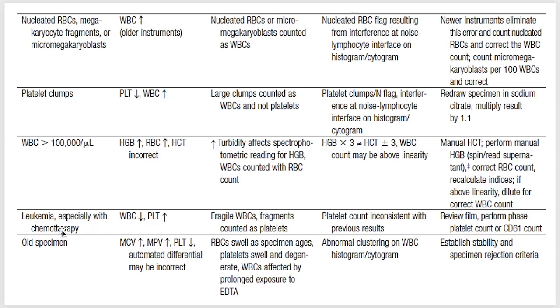Next, leukemia, especially with chemotherapy. So nag-undergo ka ng chemotherapy. So, therefore, your cells, your WBC are very fragile. So, it will be fragmented and counted as platelets. So, bumababa yung WBC count, tumataas yung platelet. So, again, all you have to do is review your film or manual check.